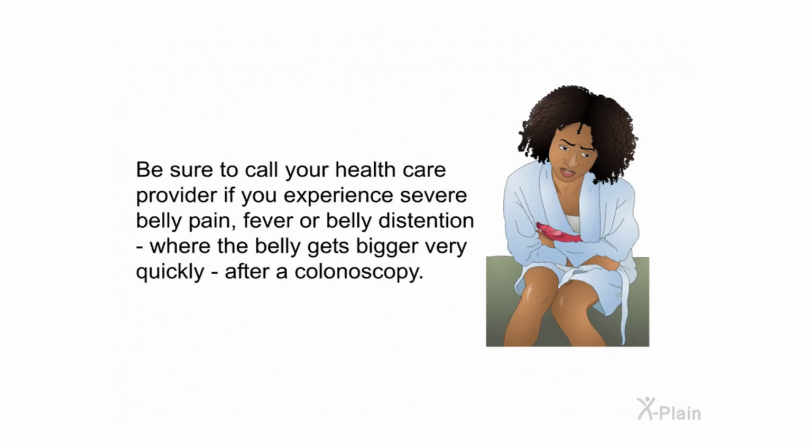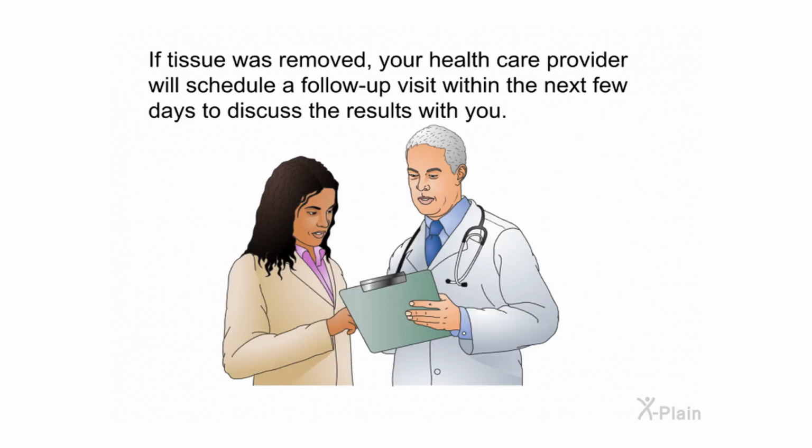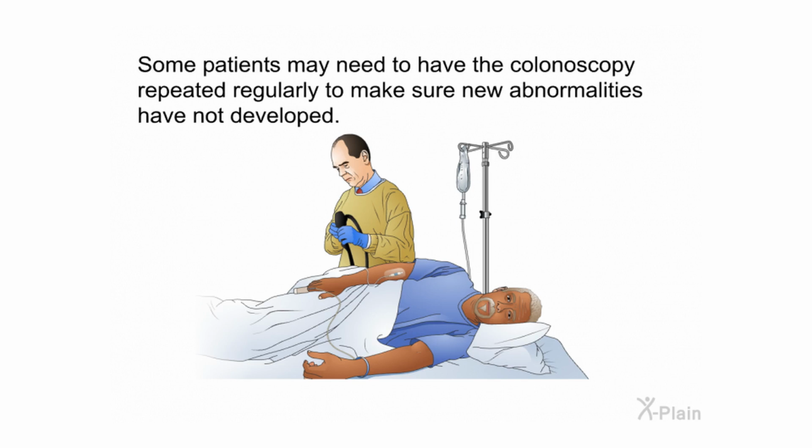Be sure to call your healthcare provider if you experience severe belly pain, fever, or belly distension, where the belly gets bigger very quickly after a colonoscopy. If tissue was removed, your healthcare provider will schedule a follow-up visit within the next few days to discuss the results with you. Some patients may need to have the colonoscopy repeated regularly to make sure new abnormalities have not developed.